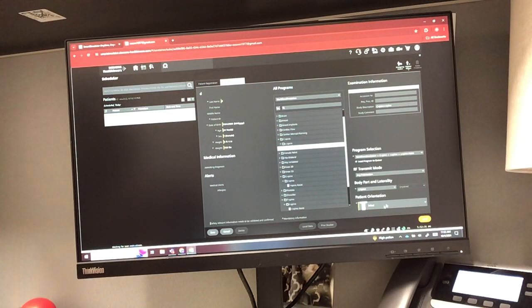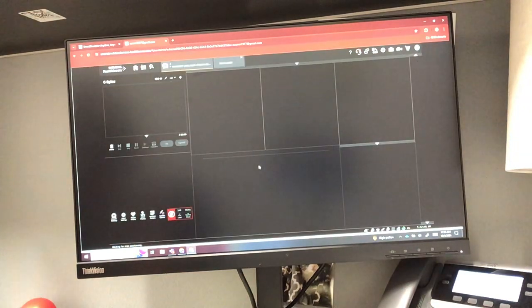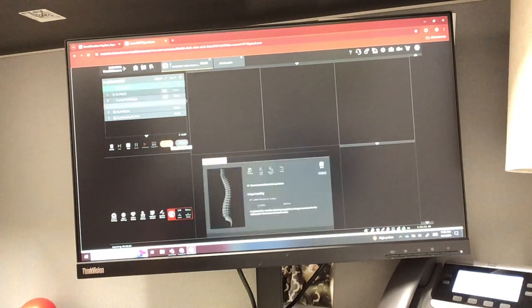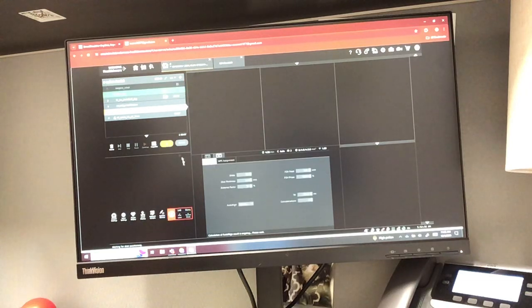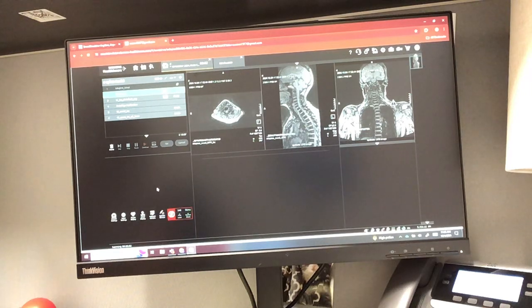and get this running so we have good stock images just so we can look at. This is not part of our actual protocol. It's just what we need so we have images to look at and scroll through and set up our planes off of. And I just want to make this all run and go. Now while this is running, I can go get my patient and set my patient up on my table.